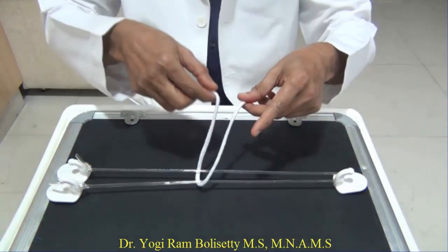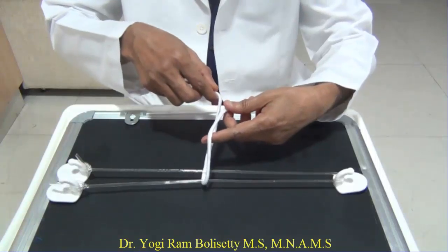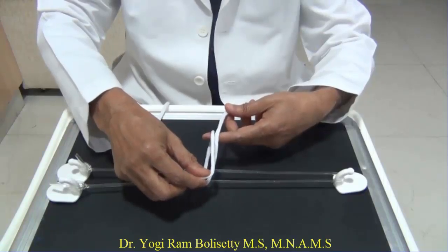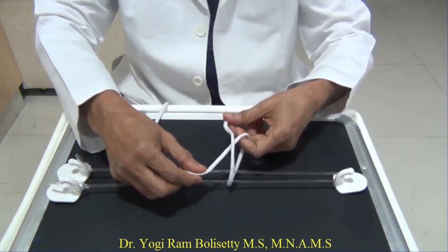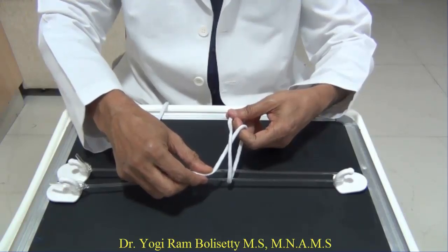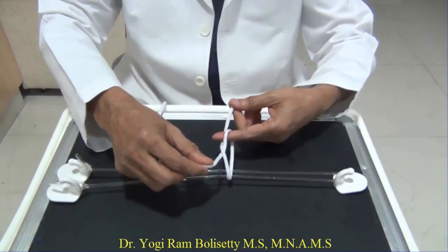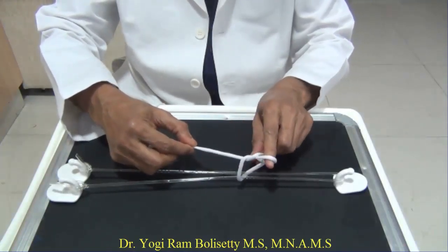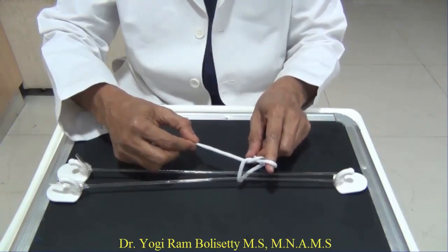Now, form a loop. Pass your index finger into this loop. Cross the long strand over the index finger. Now, you flex your index finger, hooking the long strand over it. Get the index finger over the short strand and straighten the index finger. Now, pronate the index finger. So the short strand has come through the loop outside.